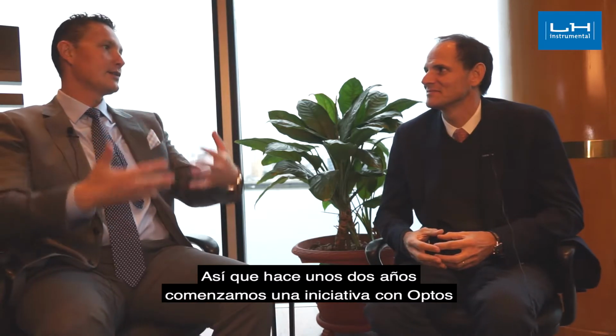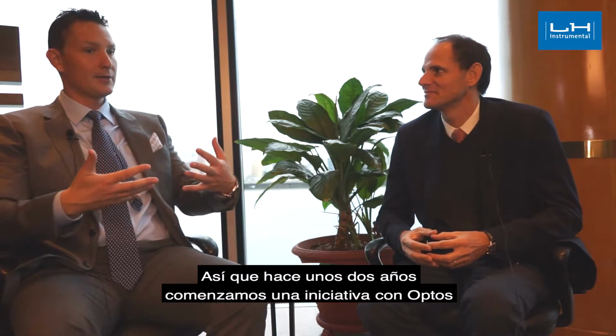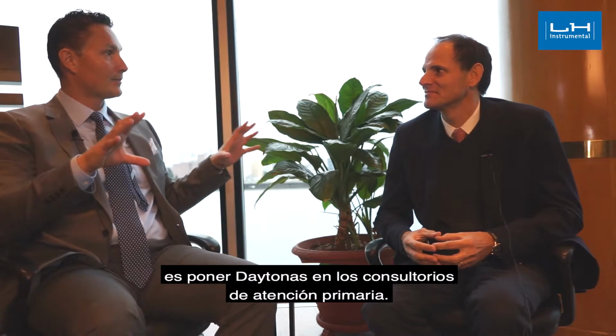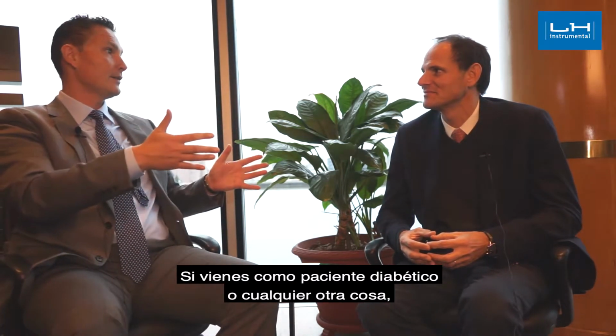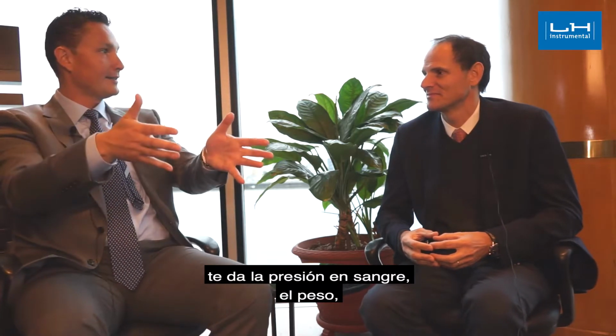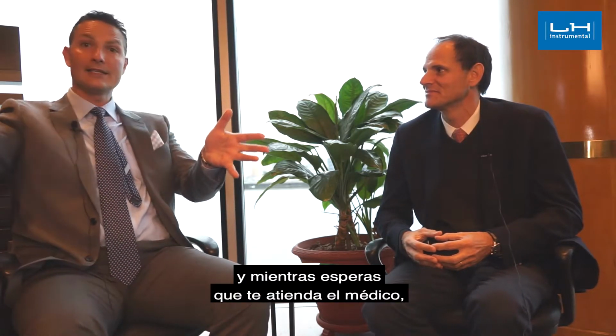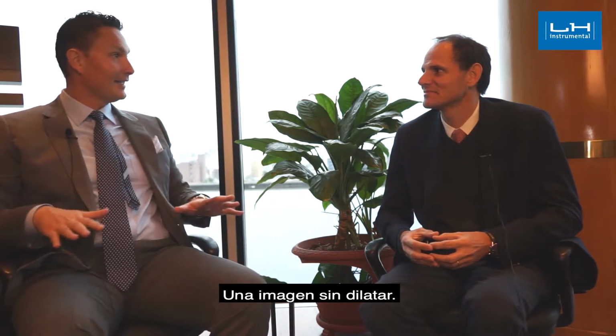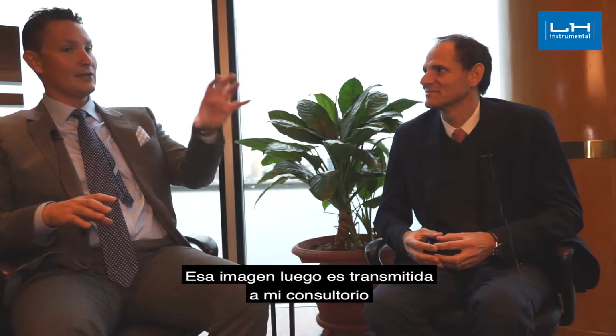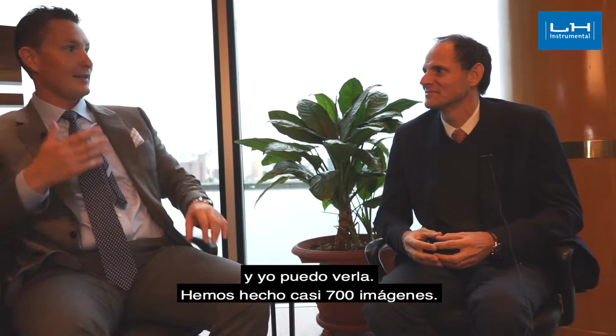So an initiative we started about 2 years ago with Optos is to put Daytonas in primary care offices. So when you come in as a diabetic patient or anything else, you get your blood pressure, your weight, and while you're waiting to see the doctor, the nurse will actually take an optomap, an undilated image. That image then is transmitted to my office, and I see it.